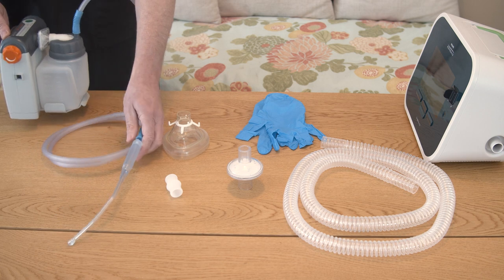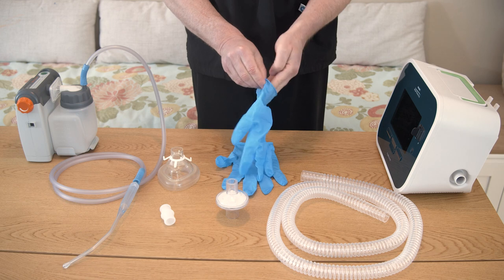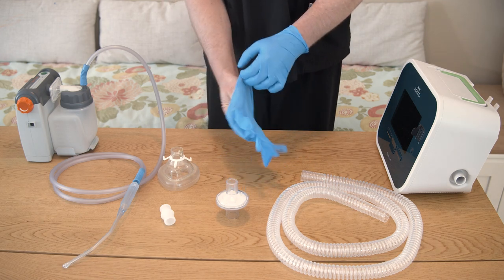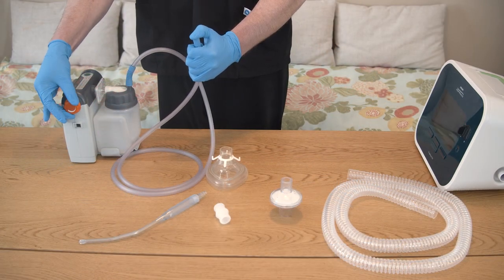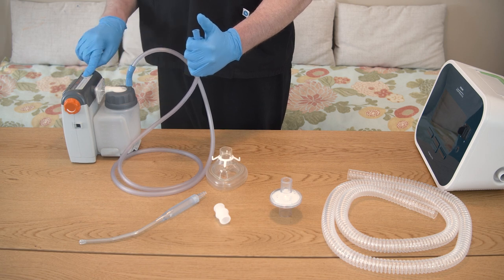If the patient uses a suction machine, gather the machine and supplies. Put on non-sterile gloves if you want to wear them — gloves are not required for this treatment. Check to make sure suction supplies are prepared and ready for use, and that the machine is working properly.